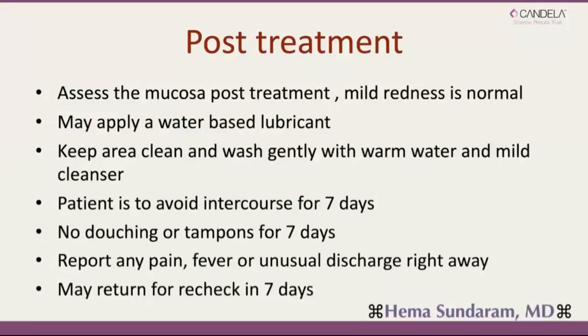And here I think we're probably about at our wrap-up time, but I will just mention finally the post-treatment, which is that we want to apply a water-based lubricant. I use KY jelly or ultrasound-based gel afterwards for the patient's comfort. It's very soothing. They should avoid sexual intercourse for 7 days afterwards, no douching of the vagina or tampons for 7 days after. Of course, they can experience a little redness, even a little soreness in that region. That tells them the treatment is doing something and it's working.